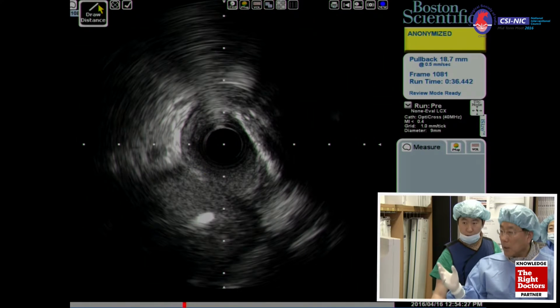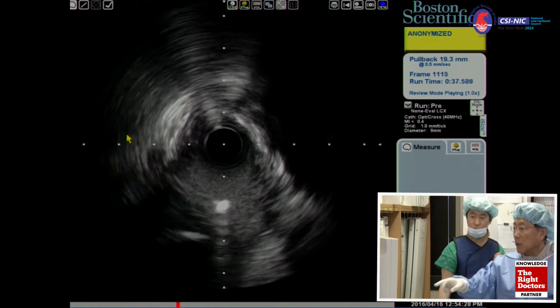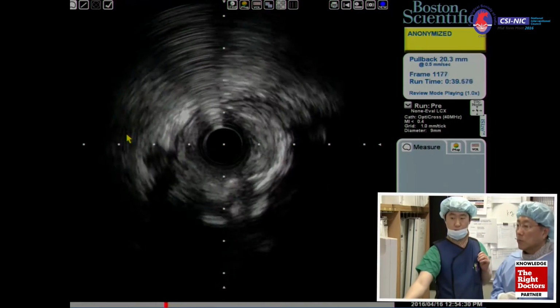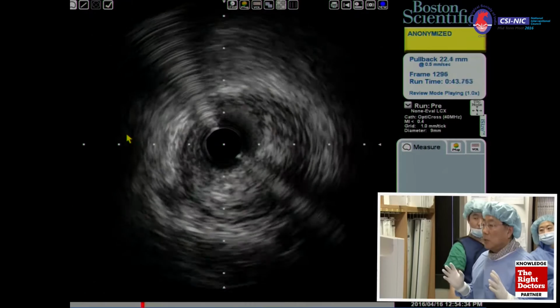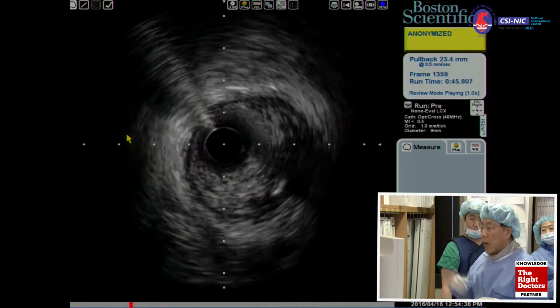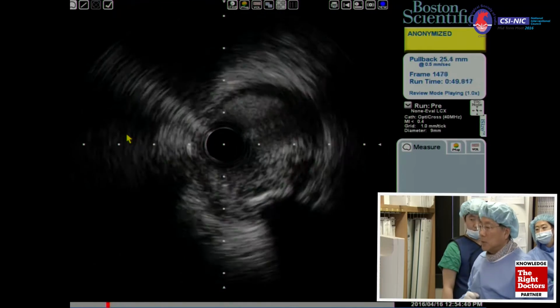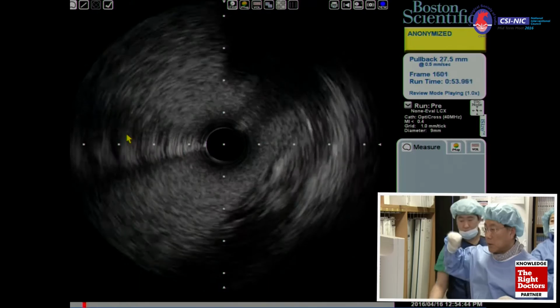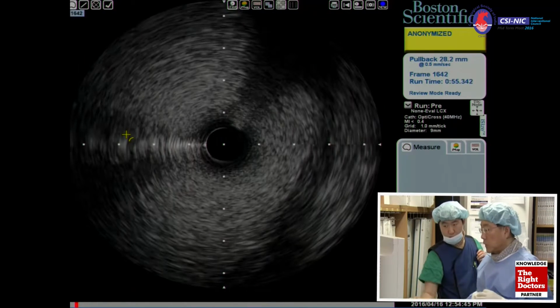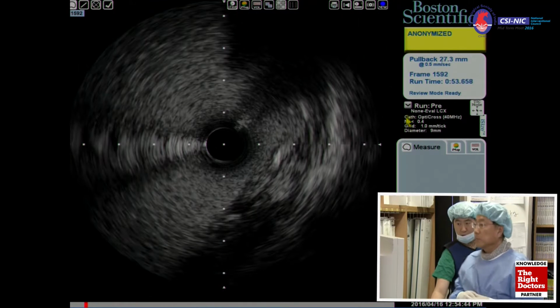Okay, go ahead. So the LAD is coming in from the 6 o'clock. This is the main disease. Size-wise, almost 4.0. Lots of plaque with mottling density, clearly related with some calcified plaque over there. The ostial part has eccentric plaque with superficial calcium. Would you show us again the LAD run from the main?